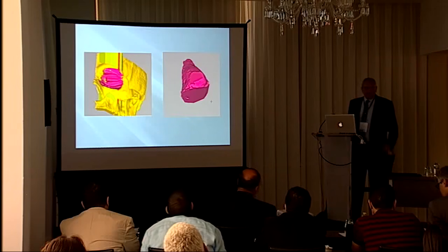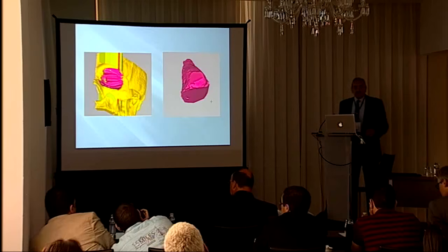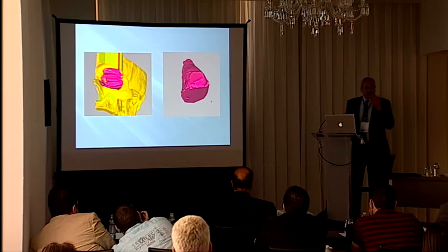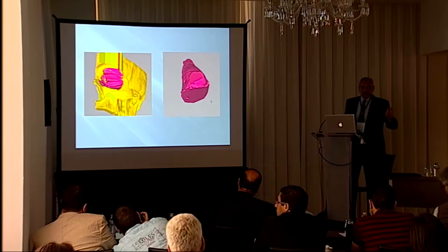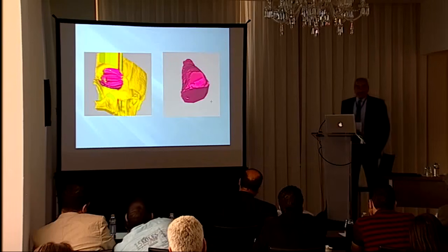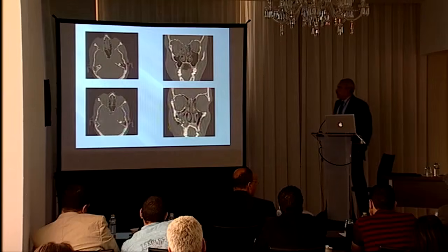Additionally, I did some measurements to know that there is a difference of 4 to 7% from the right eye to the left eye in normal individuals, and I reached, by trying to copy the unaffected side to the affected side, differences below 4%. And the results, especially with enophthalmos and ectropion, are unbelievably good.